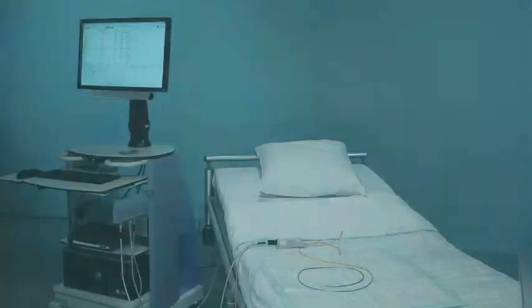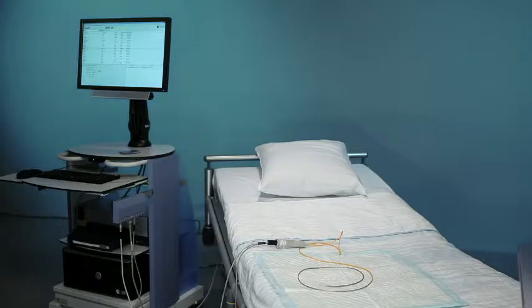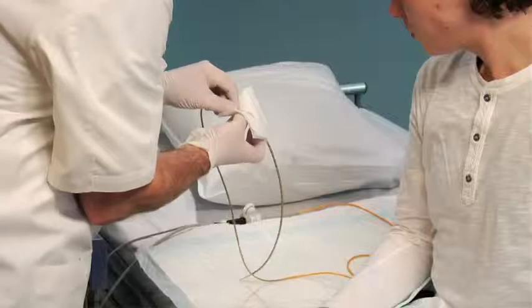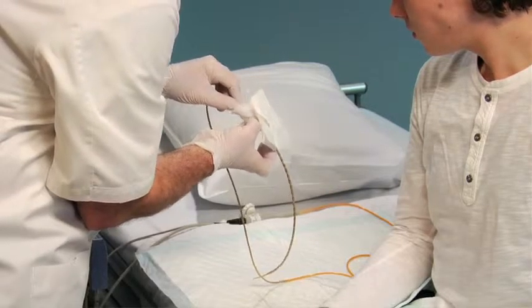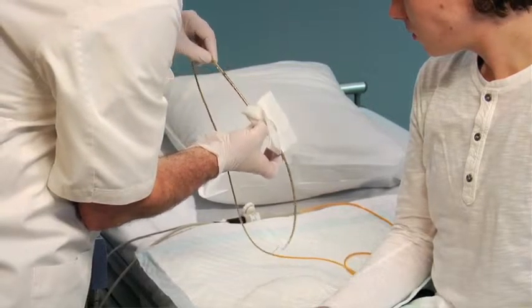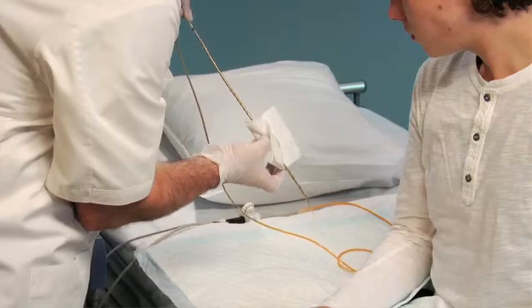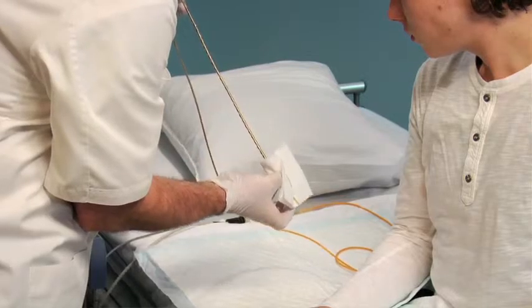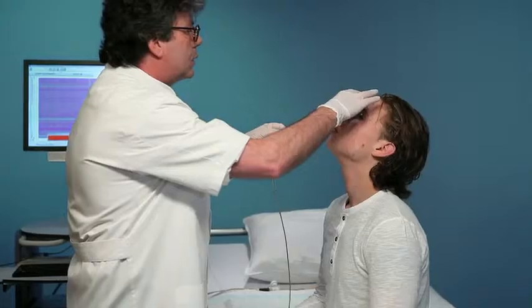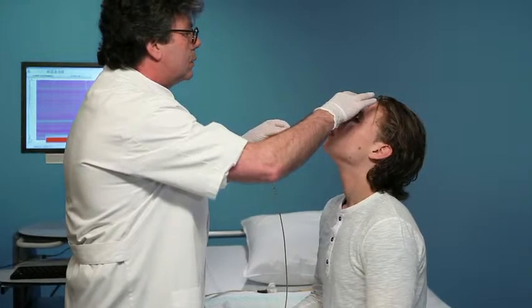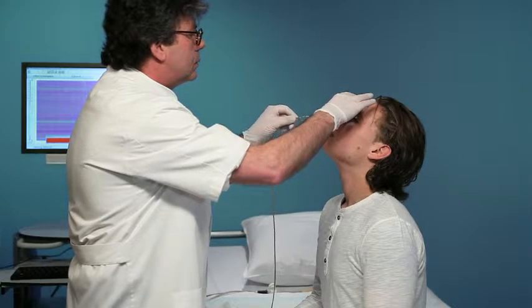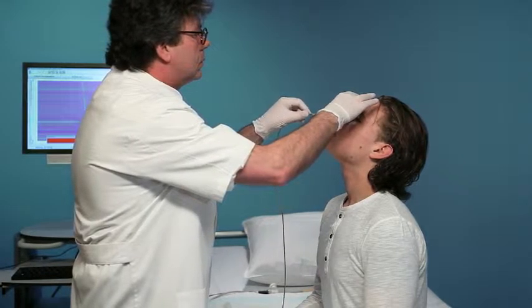You are now ready to welcome the patient. You can apply some lubricating gel to ease the passage of the catheter. Gently insert the catheter into the pharynx.